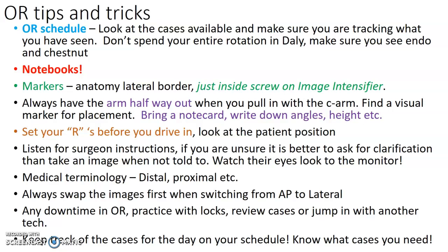Notebooks. I know I've stressed this a million times, but always have your notebook. Keep track, make notes, have a scratch pad with you, something. The markers, when you're marking the C-arms, remember that marker goes just inside the screw on the image intensifier. And anatomy, you're always going to mark the lateral border, just like we do for any extremity work. Anytime I'm doing a C-arm case, I always push my C-arm in-out controller. I always have my C-arm halfway out when I pull in.